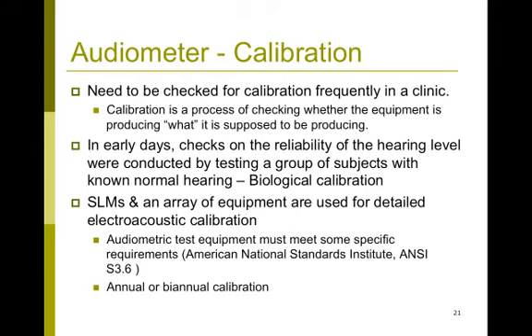That testing is more elaborate. It would involve a sound level meter and an array of other equipment, and typically it's done by engineers that we might have to rely on to do this electroacoustic calibration.